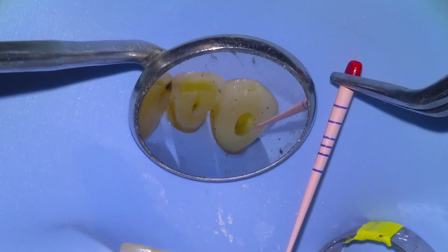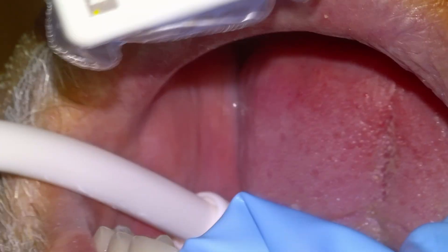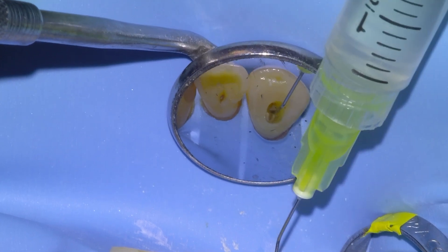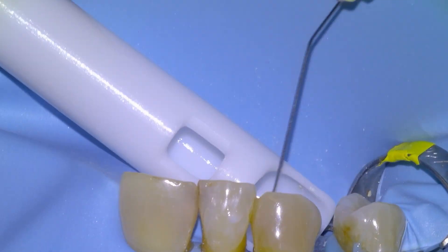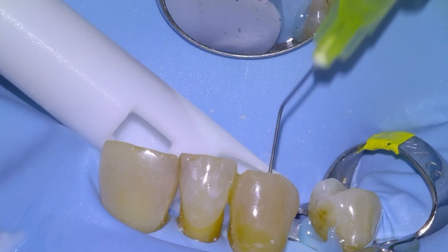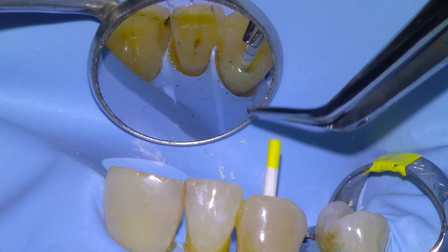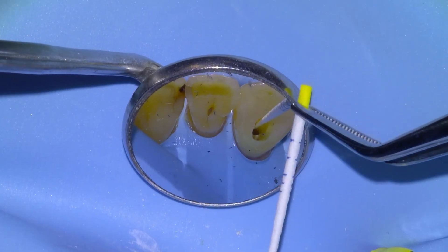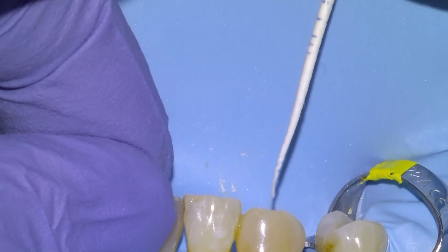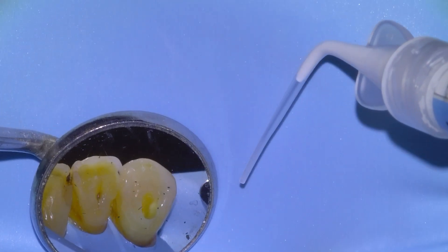We finished with a 35 and I'm going to take the cone fit with an F2, which is a 25 — I usually size down my cone. In this case we ended up maybe a little bit thin and a little bit long, so I decided to size up. I was then confident that would be an appropriate cone size, so we're going to finish with an F3. One last irrigation to ensure the canal is fully sterilized, then we're going to dry it with paper points — using thin F1/04 taper points — leaving them in for a few seconds to remove the hypochlorite. A second one comes out mostly dry and a third comes out fully dry.